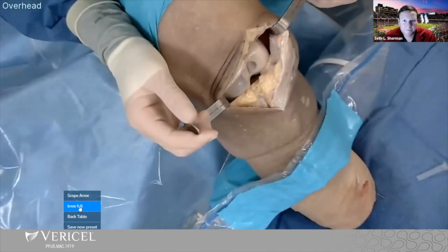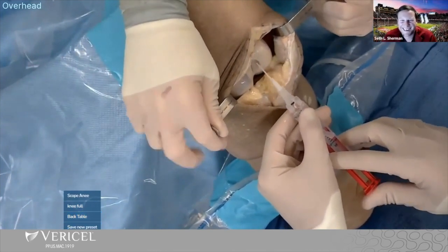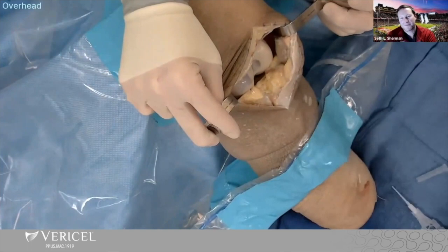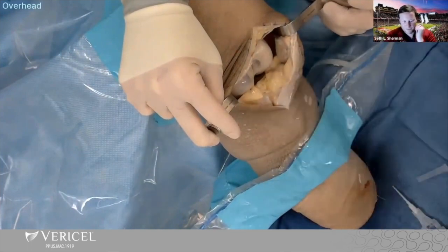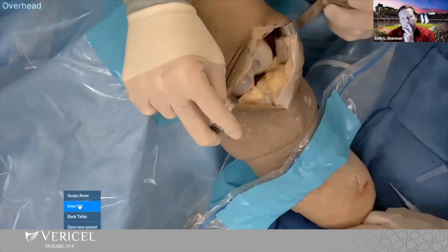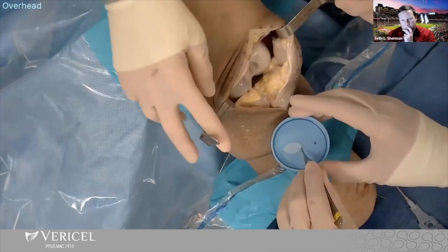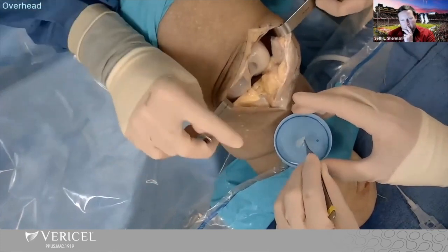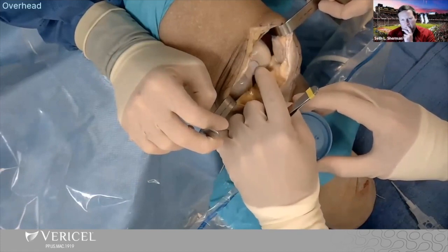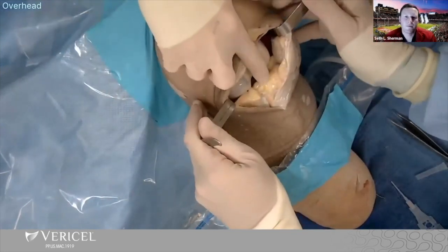Awesome — you always one-up us with your great studies. So here, I'm putting a little sealant on. Once you start activating it, it can get sticky on the tip. I put a little layer there, then we're going to put the implant on. We're assuming the bleeding has stopped — if it hasn't, we put pressure there. So we're going to try not to drop this. Everyone tries to use the toothed pickups — I find that a little challenging. The cell side is down — that's the trick. Shiny side up. Then really minimal manipulation. I always do it with my finger — I used to do it with the pickups.